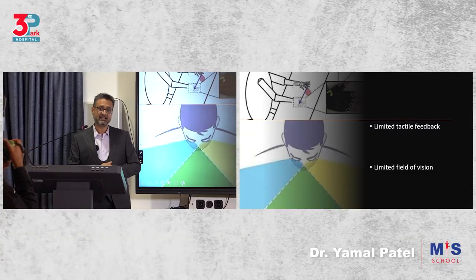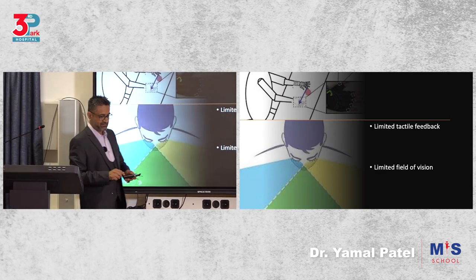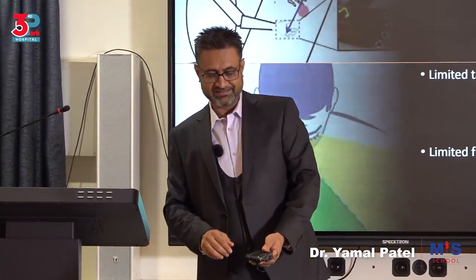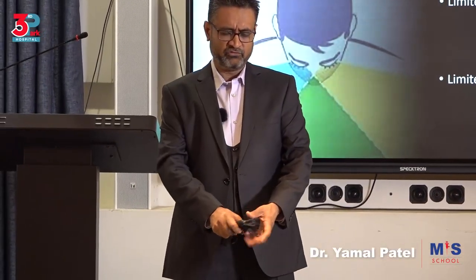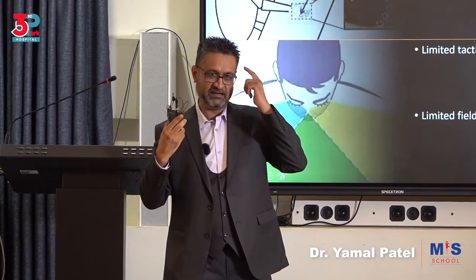Then limited tactile feedback. I tell people when we are training that if this thing was put on the table and I am supposed to close my eyes and I just feel it this way, I don't need to be told what this is. I will still understand.